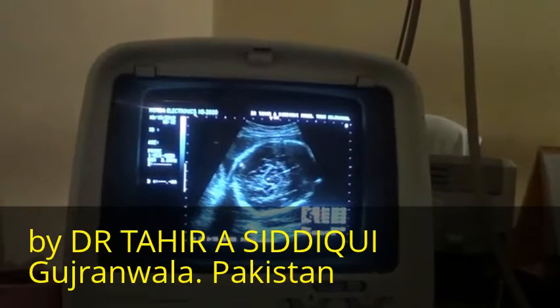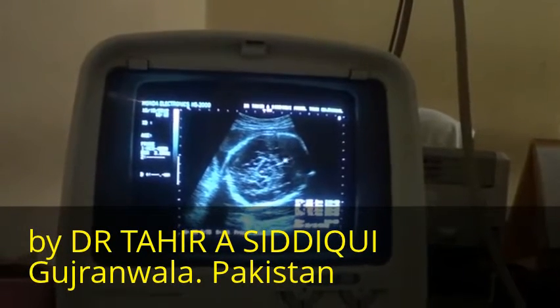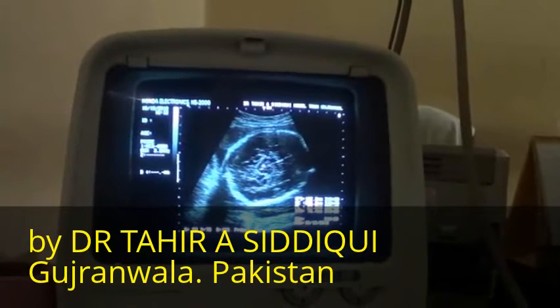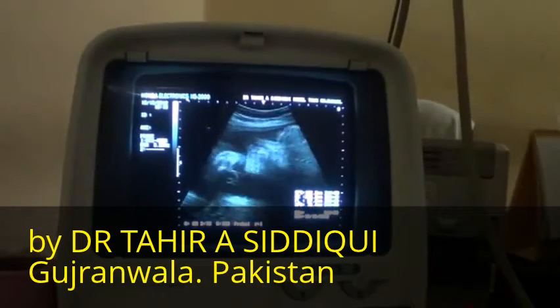Now this is the cranium, the skull bone, normal, and this is the falx cerebri, this line. This is the cavum septum pellucidum. These are the thalami, and there is no dilation of the ventricles.